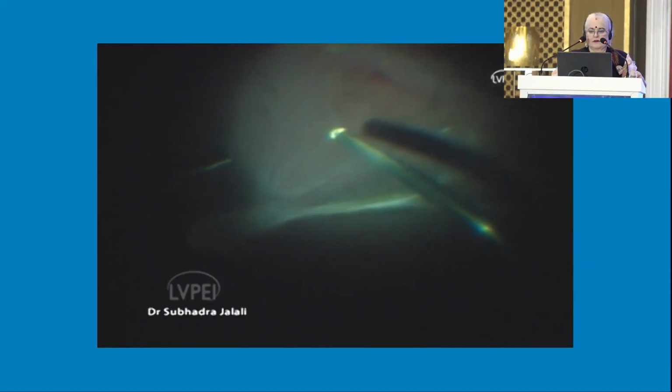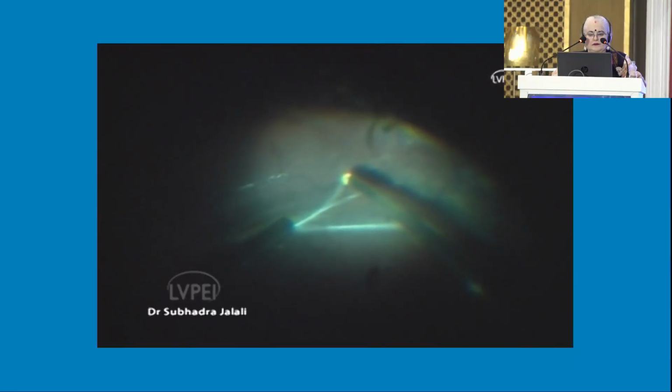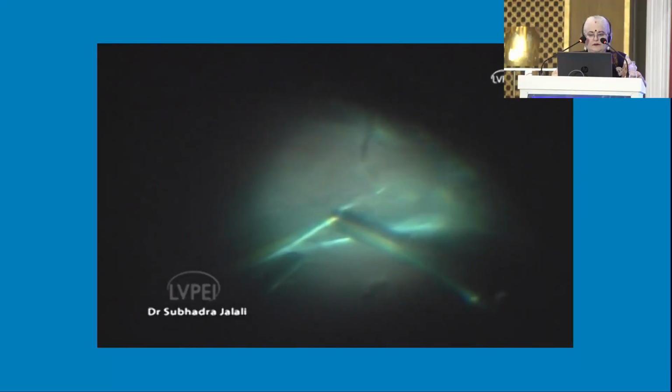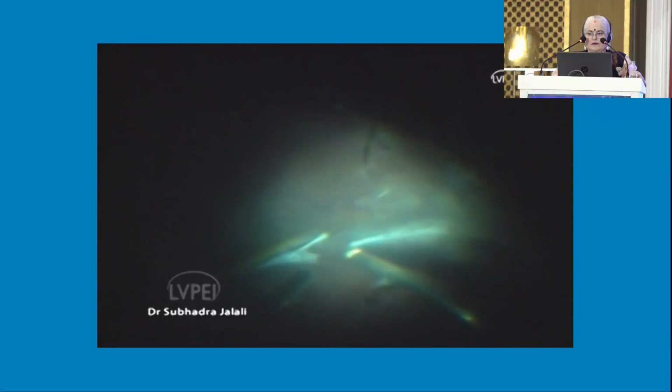Many people would have just done a laser, but that doesn't work because, as you will see in the video, there is a lot of vitreous covering that avascular retina. So we are trimming this persistent fetal vasculature stalk, which is going from the disc to the periphery.